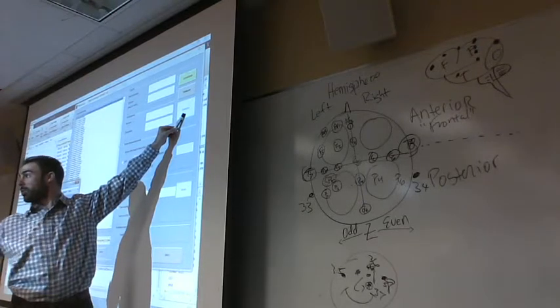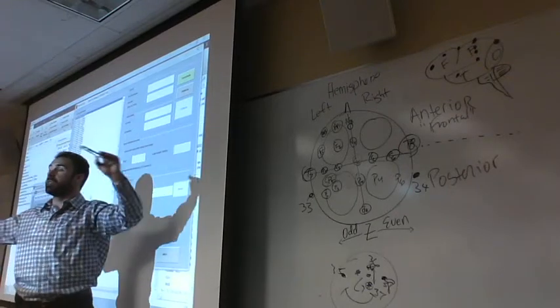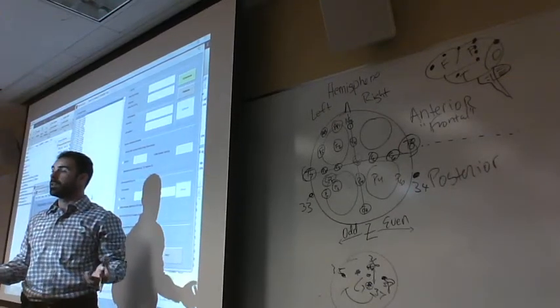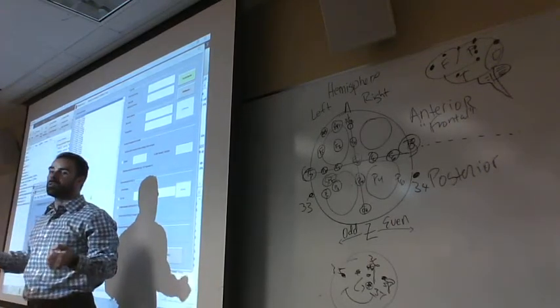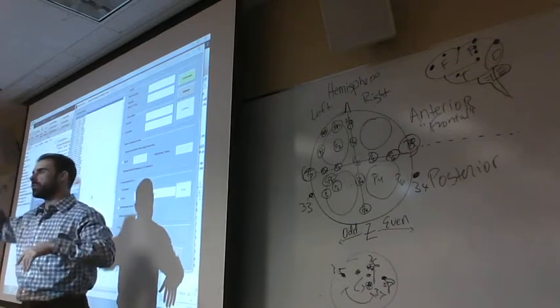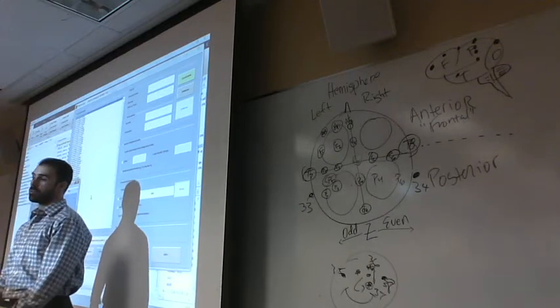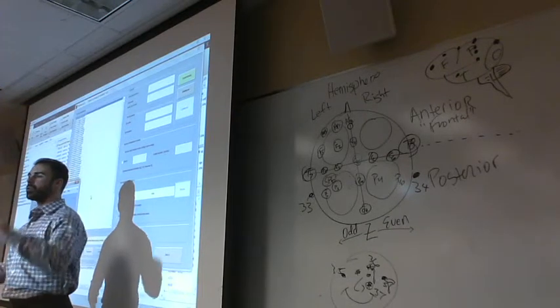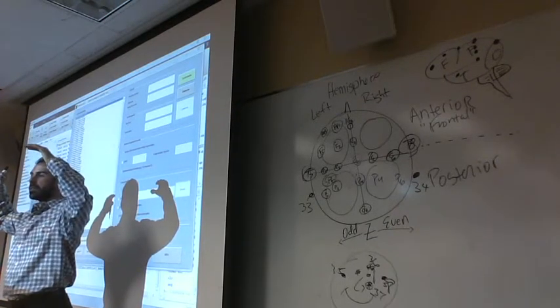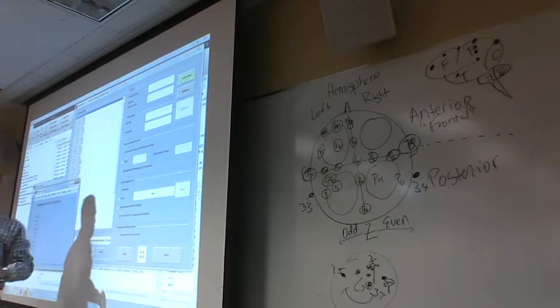Is everybody on board? So we do this whenever we build an events list; this is one way to do it. Now, what you can also do is import an events list that you write instead of going through this manual process every single time with buttons and clicks, which is really nice and helpful to learn and start with. Eventually, you get bored out of your mind, and it also leads the way to mistakes. You can also write it in a text file or an Excel file and save it as text so that it automates it a little more clearly. And that's what this is here. So you can do that if you need to.